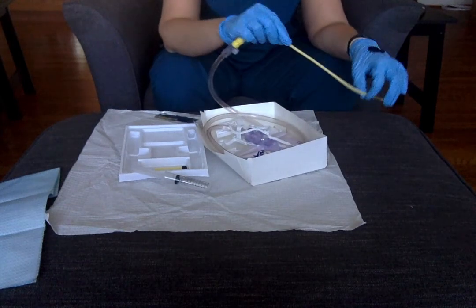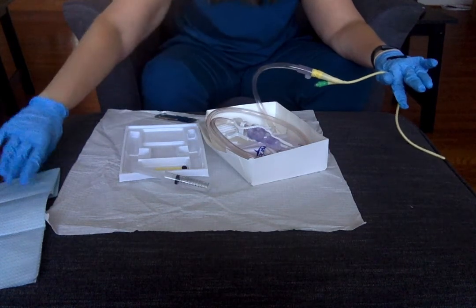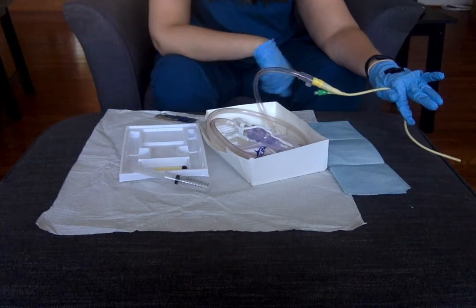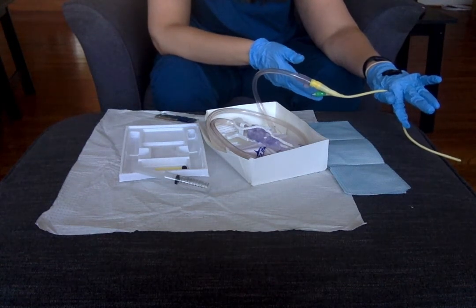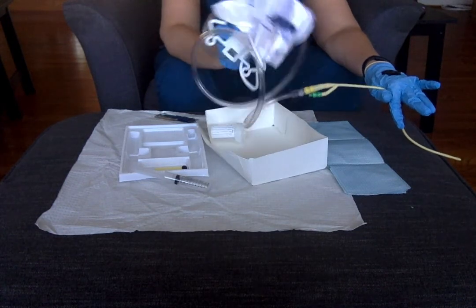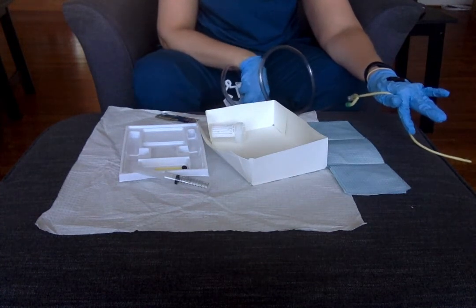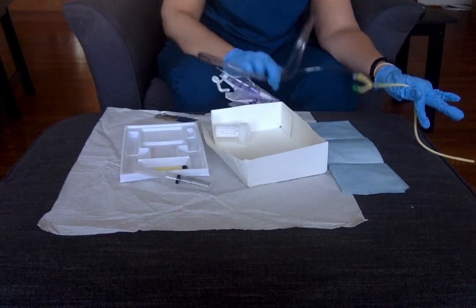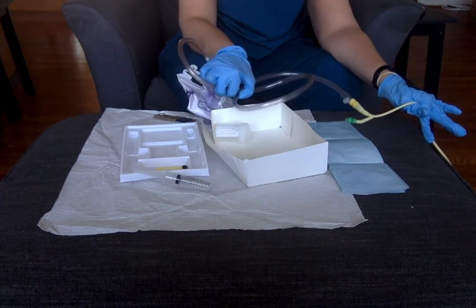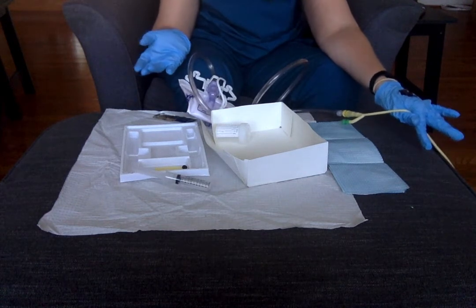So let's say my patient has the catheter inserted — this is inside my patient right now — and I have an order to remove it. You do want to make sure you get a chucks pad and tuck it under your patient as an absorbent pad, so that if urine dribbles out of the catheter at the end, it's not going to get on the bed — saves you a linen change. Of course, verify your order and let your patient know what's going on. You do want to prepare first: make sure you've hung this urine drain bag below the level of your patient on the bed, on a non-movable part of the bed, and you don't want any dependent loops. This loop here — this up-and-down loop — this is bad. If I turn it sideways on the bed, that's okay. You always want the urine to be moving downward; you never want it to have to fight back up against gravity because it'll sit in the tube and grow bacteria.